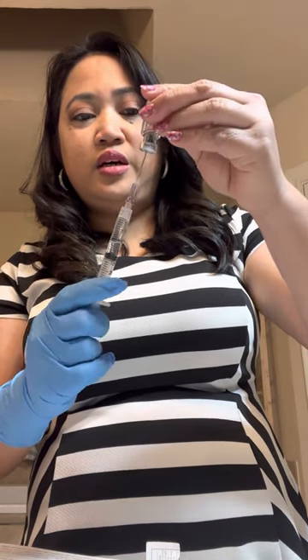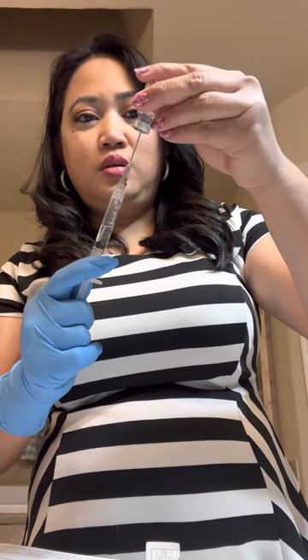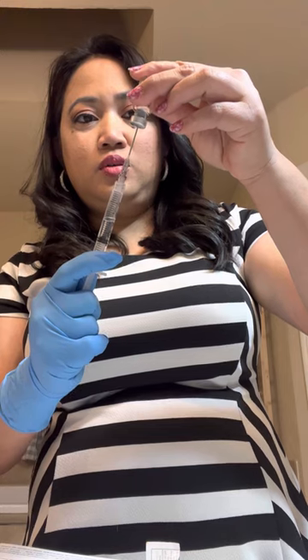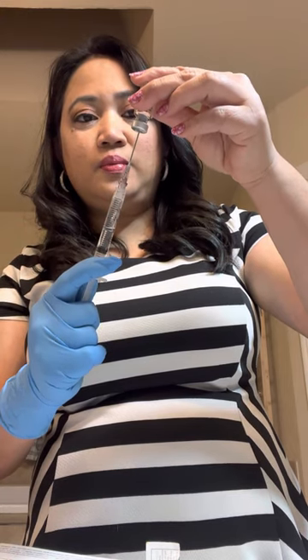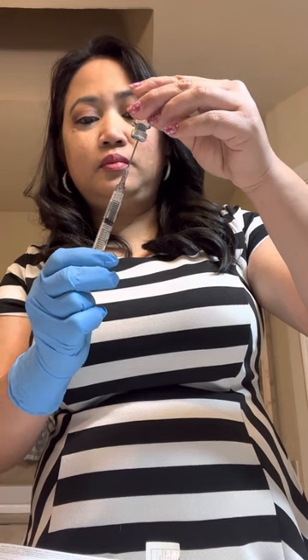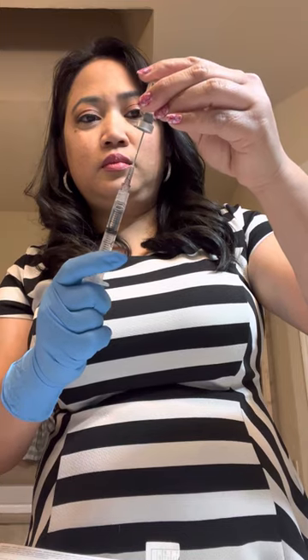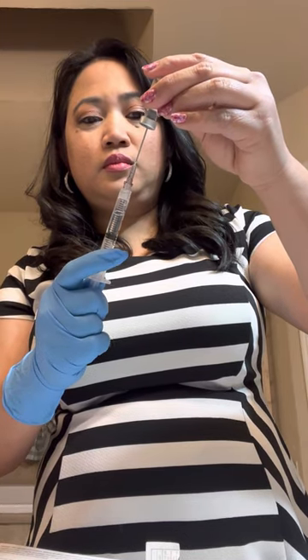My dose is 150 IU. You can't really use an insulin syringe because insulin only goes up to 100. For 150 IU, the volume is going to be exactly 2ml — so 150 IU equals 2ml or 2cc.